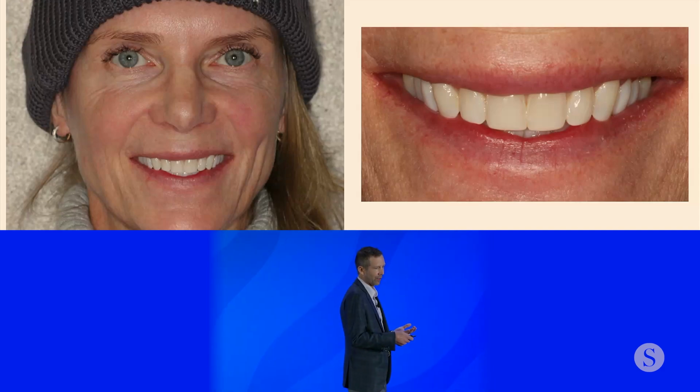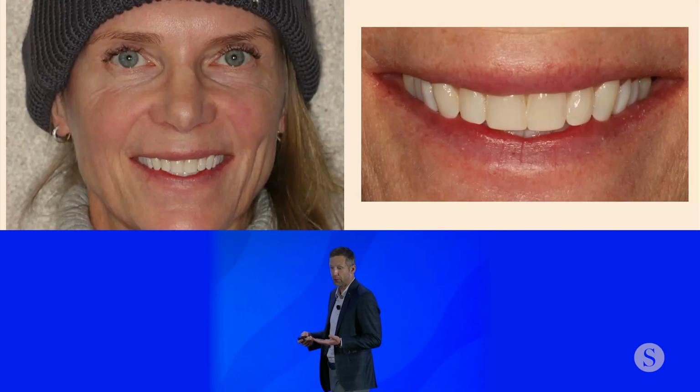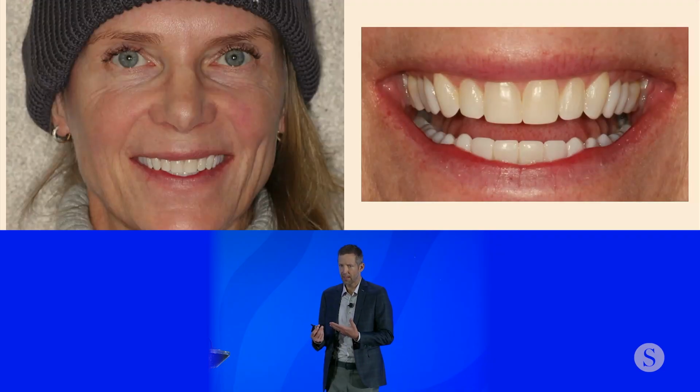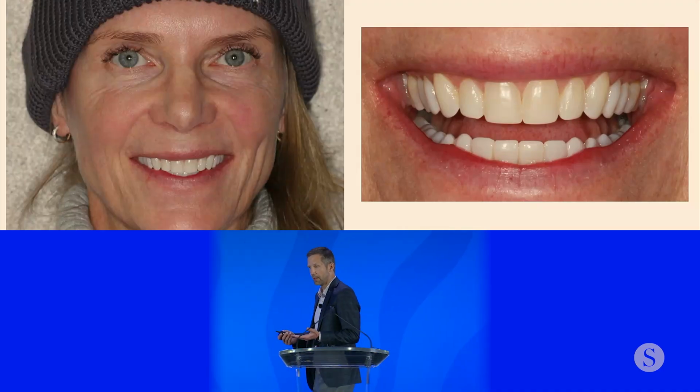Now, this is a very difficult case. You can't really bond this and change the edge position without actually prepping the tooth. So what I did is I tried to give her an idea of what a Smile Design might look like, just so we can get on the same page. Now, the difficulty with Smile Design is, can you execute it? That's always been the difficulty.